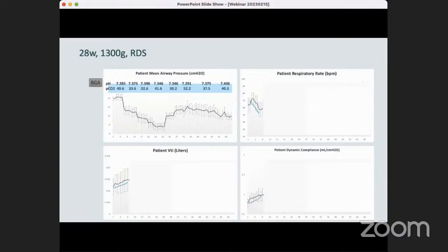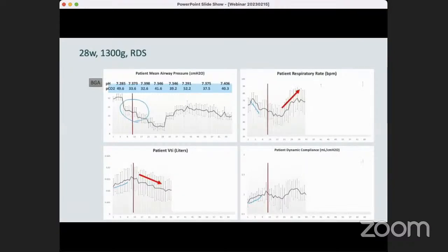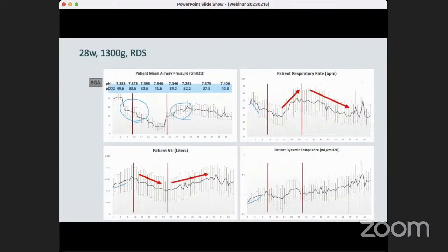So, the inspiration pressure from the ventilator is lowered, and then the MAP in the upper left is lowered. What do you think? The tidal volume decreased, and the respiratory rate increased as a result. After the pressure setting was tightened because of the elevation of respiratory rates, the tidal volume was increased again, and the respiratory rate was observed to be decreasing.